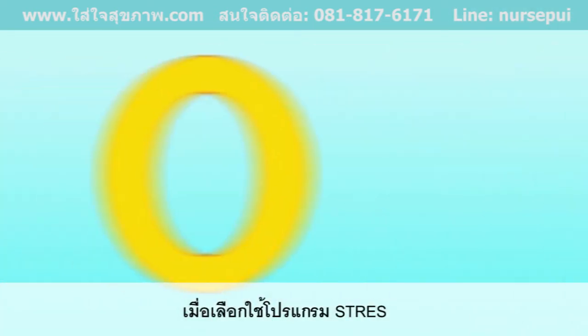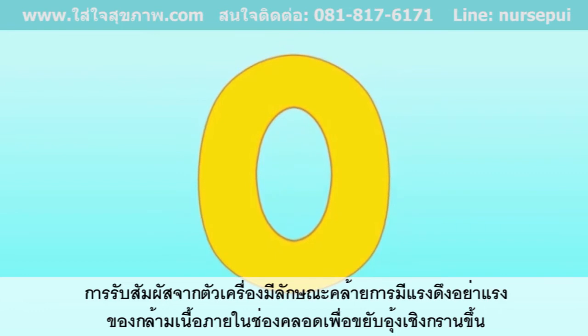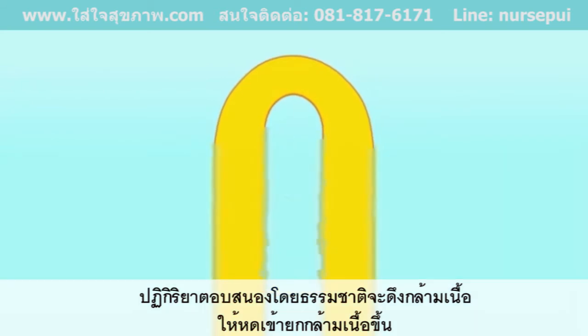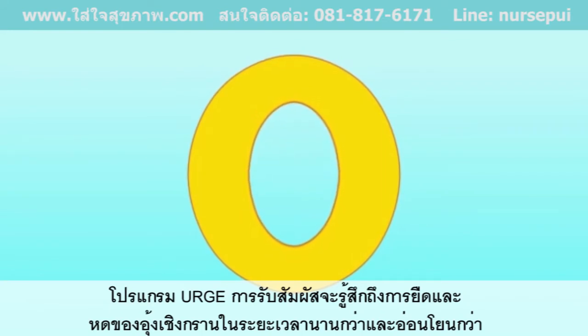When set to use the Stress program, the exerciser stimulates a sensation which feels like a strong drawing in of the vagina and pulling up of the pelvic floor. Your natural reaction will be to pull in and up with your muscles, thereby exercising and strengthening them. The Urge program stimulates a sensation of longer and softer pulling in of the pelvic floor.